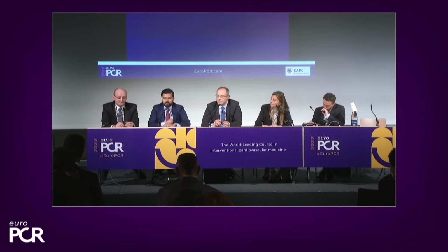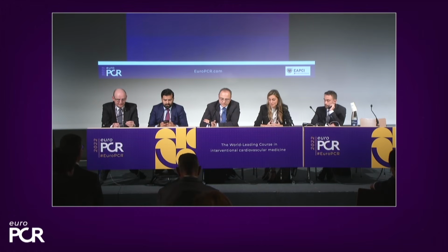Valeria. Yeah, I want to echo actually Adrian about the main concern, because if you use a drug-eluting balloon and then you have a dissection, what is going to be your next step? A major dissection, I mean. But I think, the way I use it, and I think there's a big potential for drug-eluting balloon in side branch dilatation.